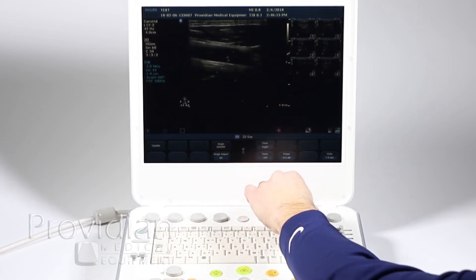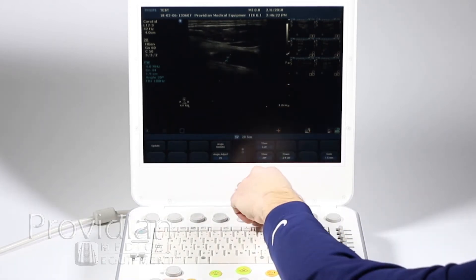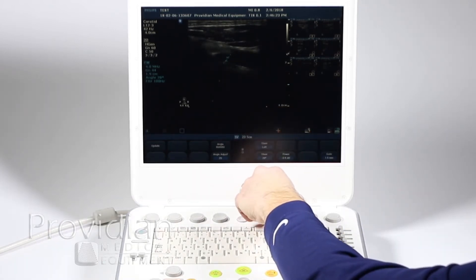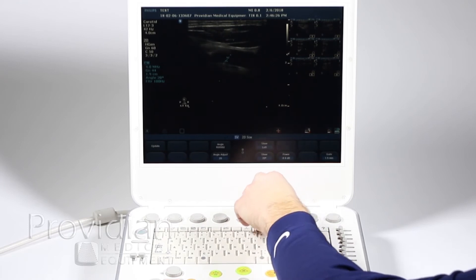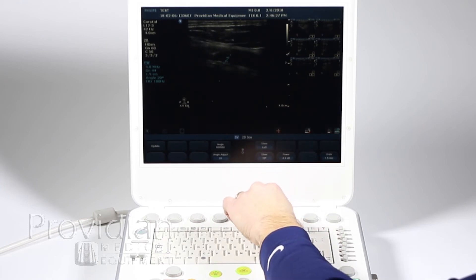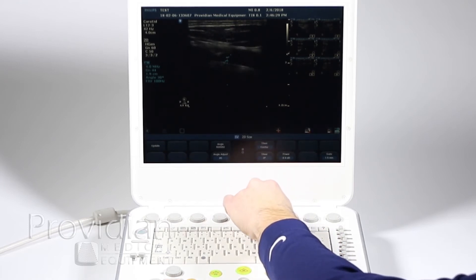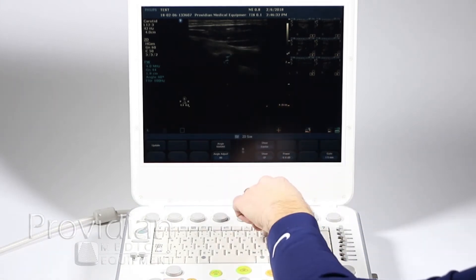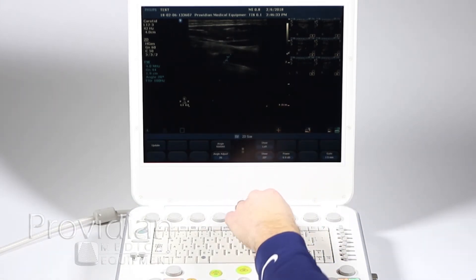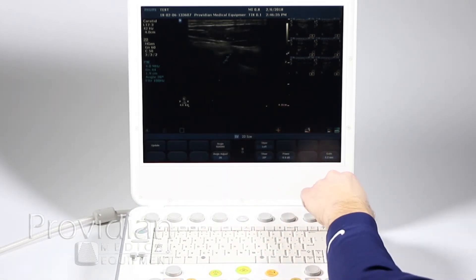I have my steering. I could steer that sample volume through here, or just click left, right, center, and you can see how that sample box changes size. So we can also change the gate size here.